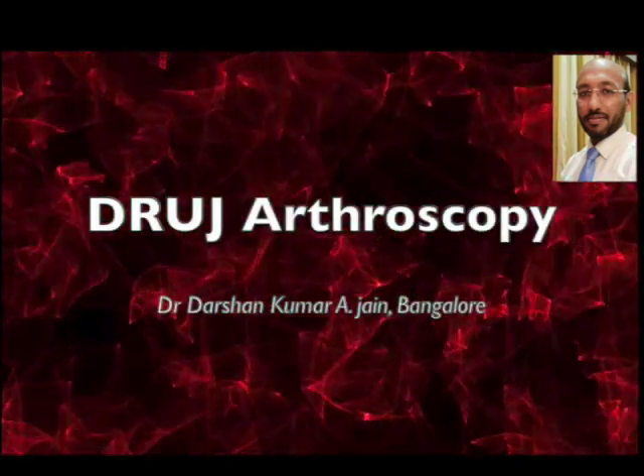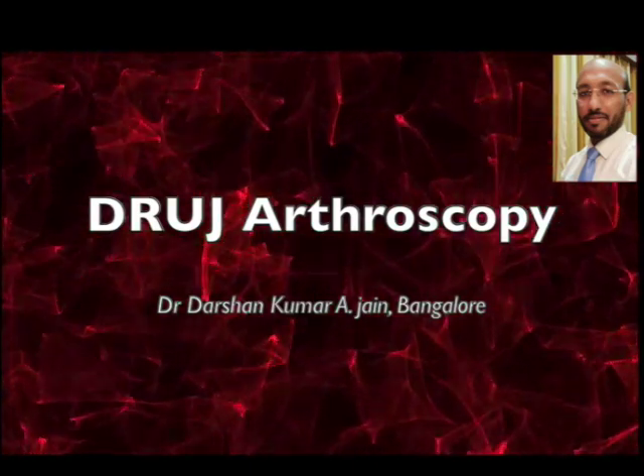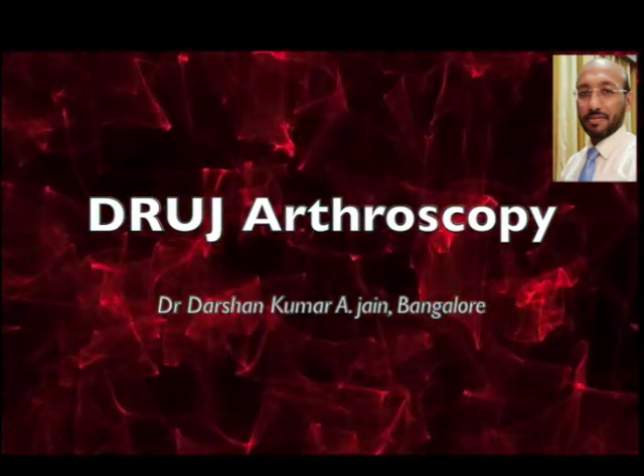Hello everyone, this is another video of the arthroscopy of the small joint that is the distal radio ulnar joint, called the DRUJ.